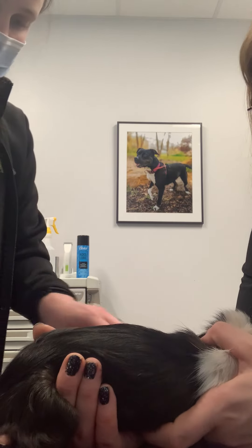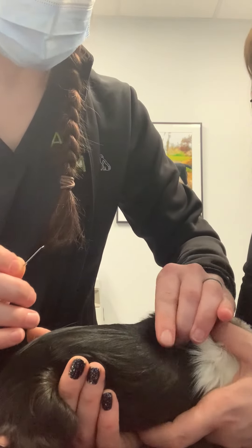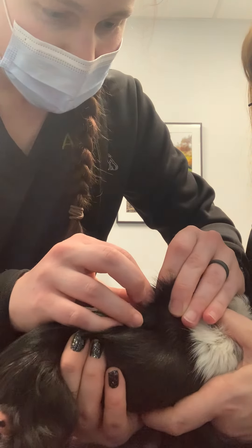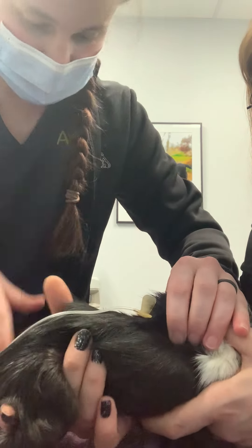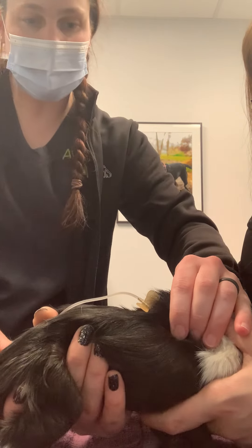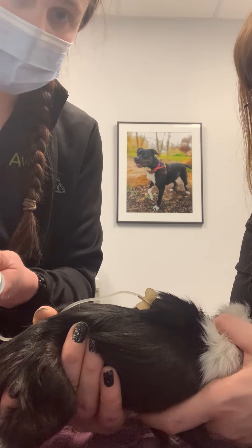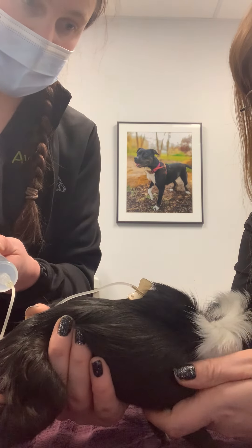Guinea pigs really tend to hate their subcutaneous fluids. So I'll tent the skin here, I'll insert my needle, and then I'll give a little bit just to make sure he's bubbling up — and he is. So then I'll just push the fluids as fast as I can.